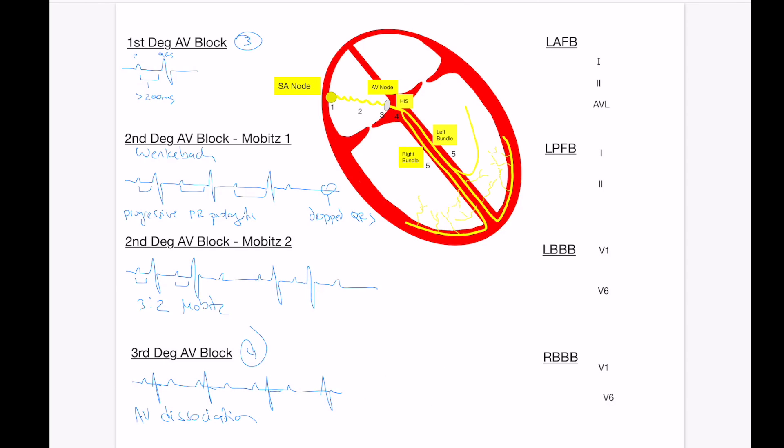Now briefly, which I'm going to talk about afterwards, two to one AV block can be tricky. This can technically be either a Mobitz I or a Mobitz II. And we'll talk a little bit about this in a minute.